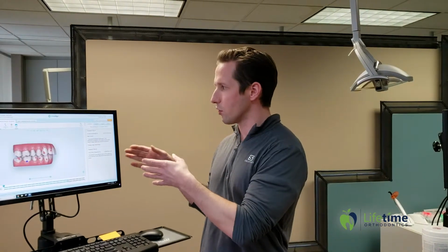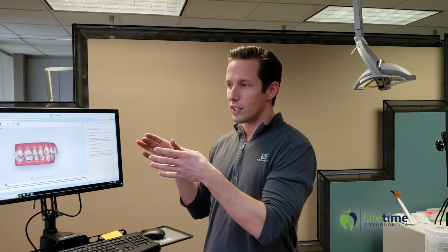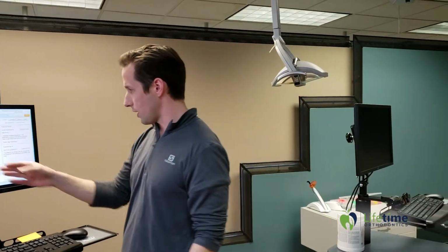So today I want to show you the behind the scenes of Invisalign, and in particular the Clin-check portion. What is a Clin-check? The Clin-check is what we get back. It's the computer program. We send in photos, we send in the intraoral scan, which is the 3D models of your teeth, and then the x-rays. And the technicians at Invisalign, they send us back something like this, okay?